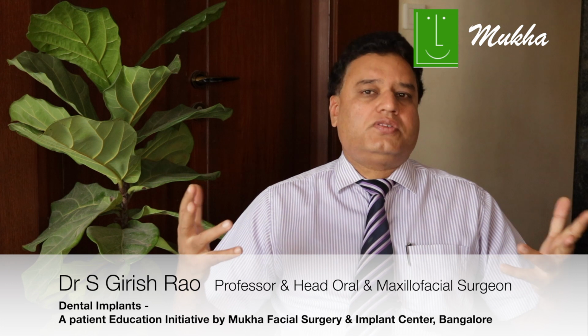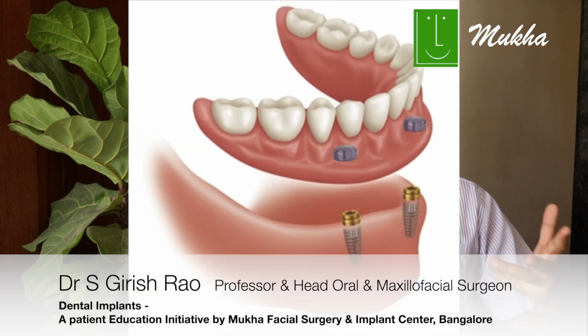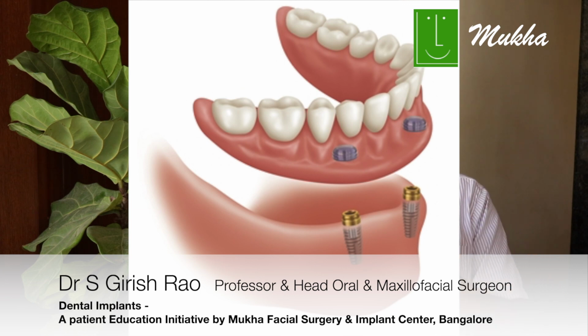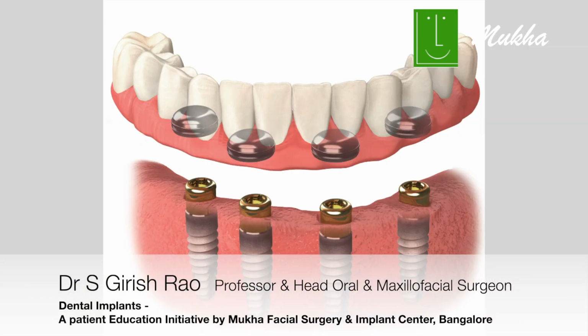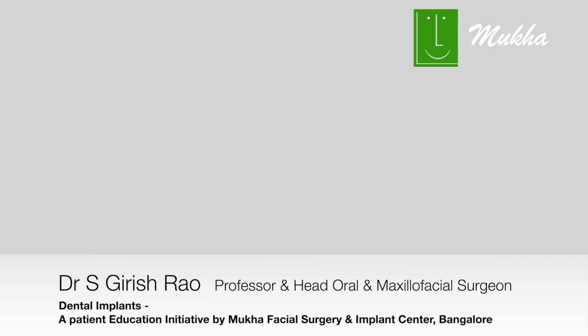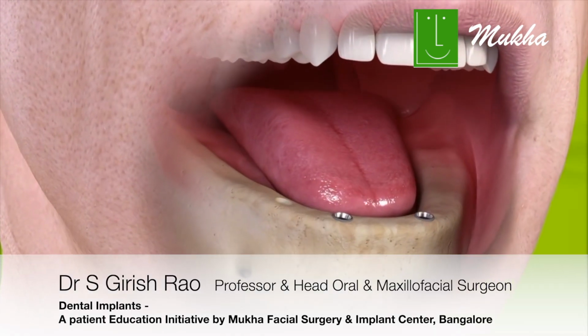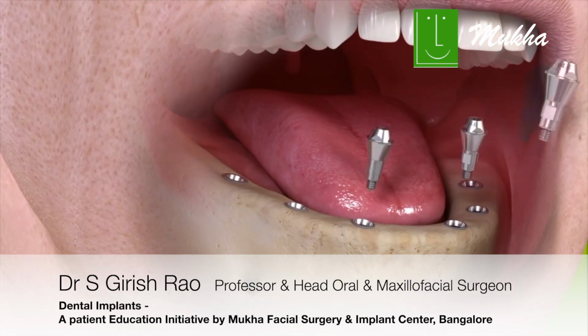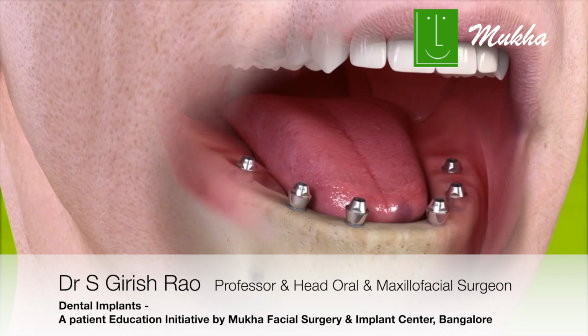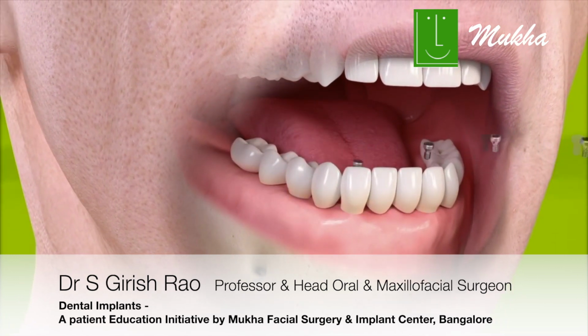And there are two ways in which you can do this. You can anchor just a couple of implants, 2 or 3 implants, and have a ball and socket arrangement or a bar attachment wherein your denture can be clipped on to these implants. But still you have a denture with that. Or you put in multiple implants, and with this you can give a completely fixed option where you can do away completely with your dentures. So based on 6 or 4 implants or 3 implants, many times you can give a fixed bridge directly per jaw.